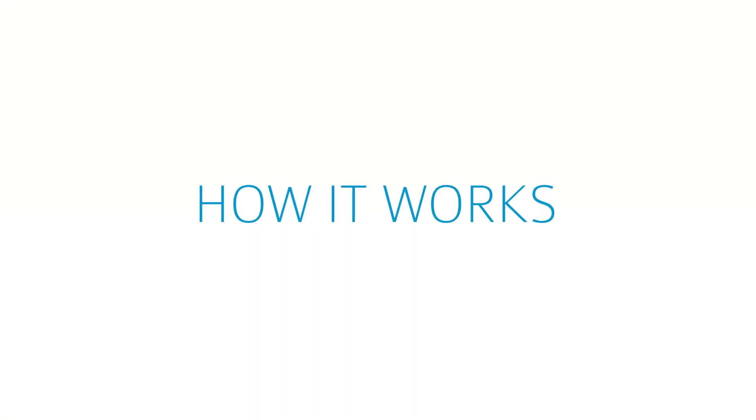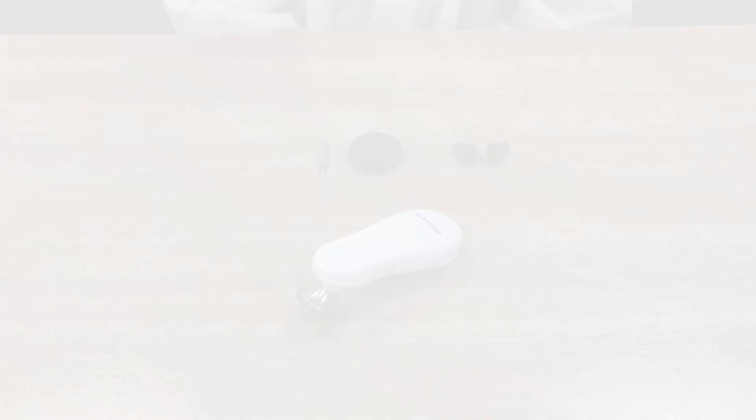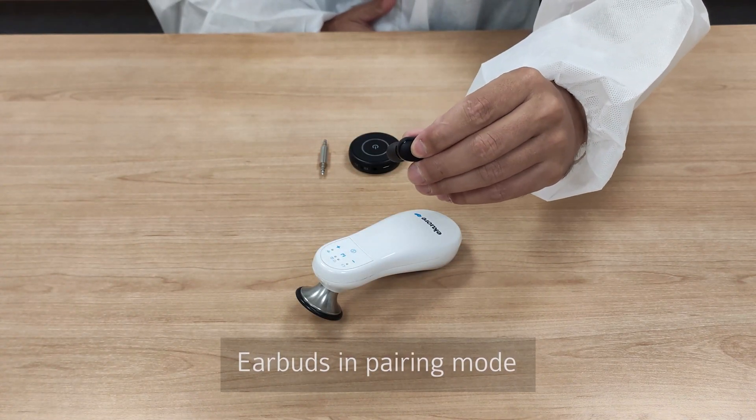When you use the device for the first time, please follow these steps to configure the system. Put the earbuds in pairing mode as shown in the manufacturer's manual.